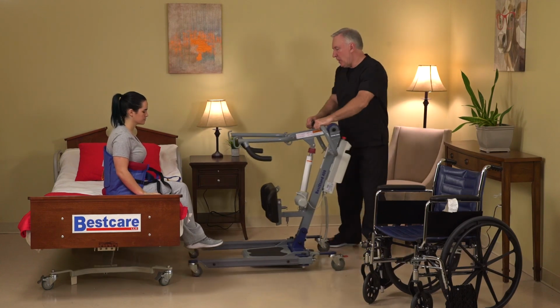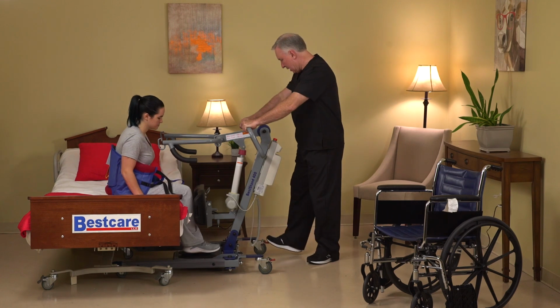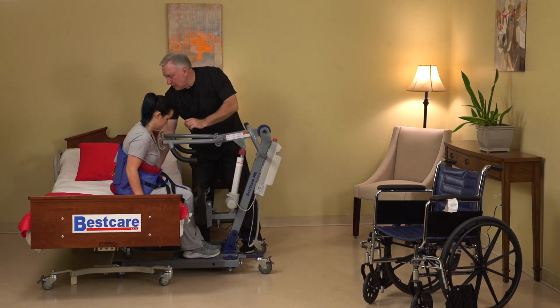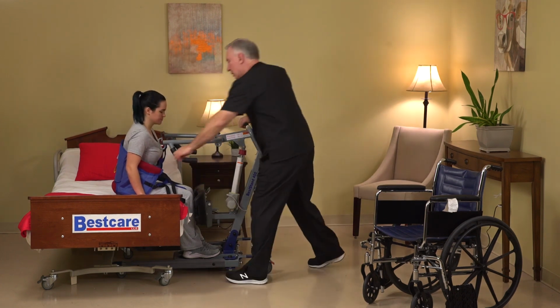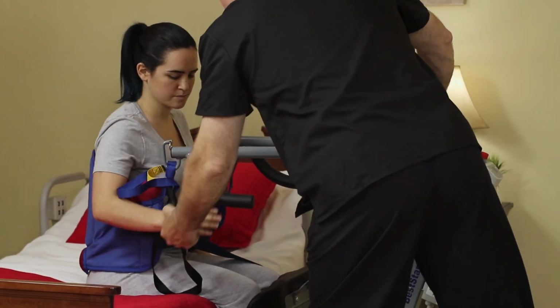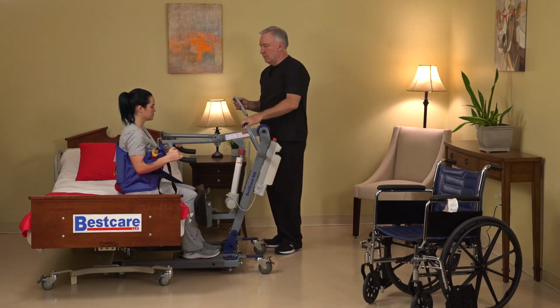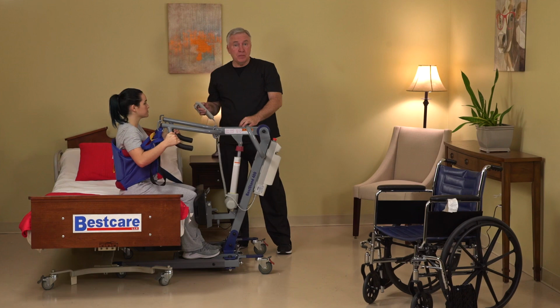Bring the device up to the patient. The patient's knees go up against the knee brace. Lock the wheels. Connect the sling to the hooks. Patient holds on to the handles. And then raise the patient into the standing position.